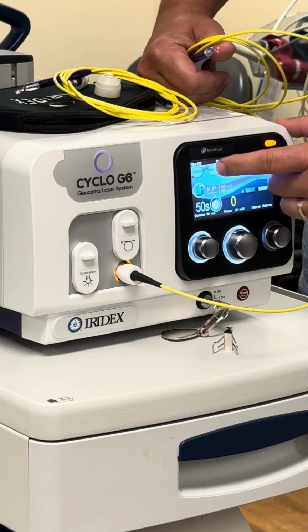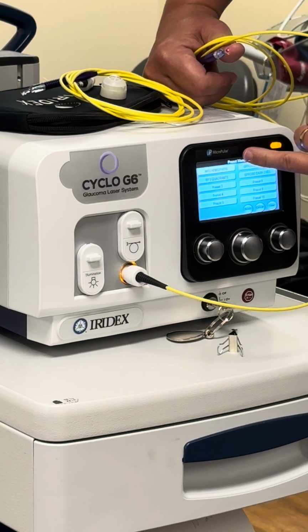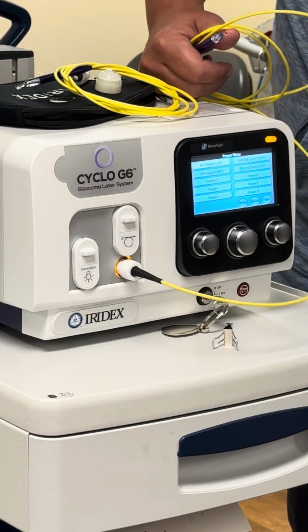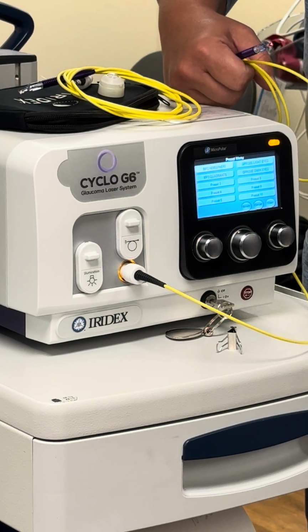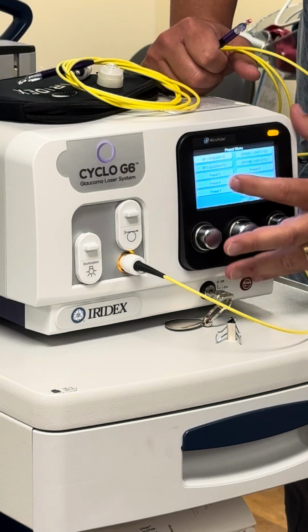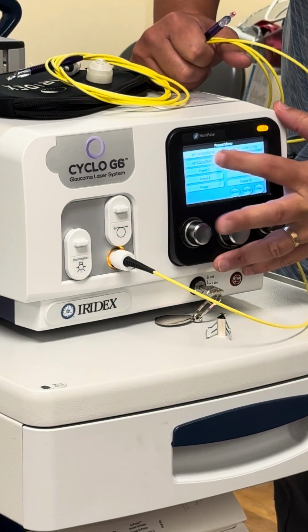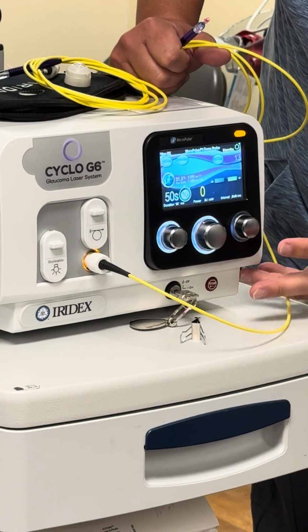Presets, sorry. Presets is up here, and it's got MP3 hemispheres or MP3 quadrants. So whatever the doctor wants to do, they can do either a whole half of the eye or they can do the 4 quadrants like I mentioned. So most are doing quadrants. So I click that and I hit select.